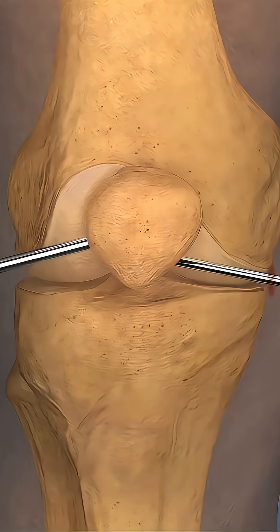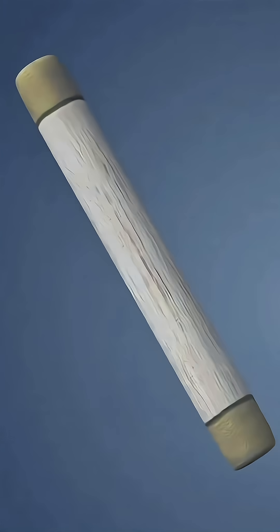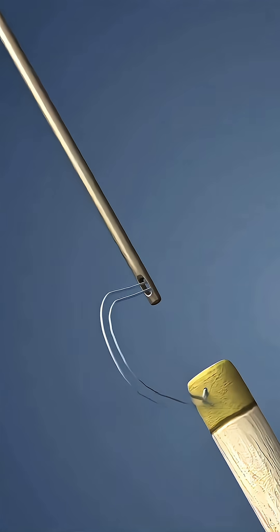Arthroscopic portals are created and the torn ACL remnants are debrided. A graft is harvested — commonly hamstring or patellar tendon — and prepared.